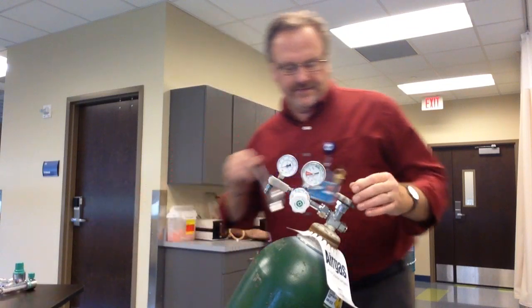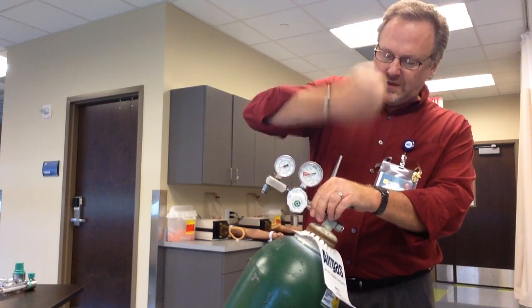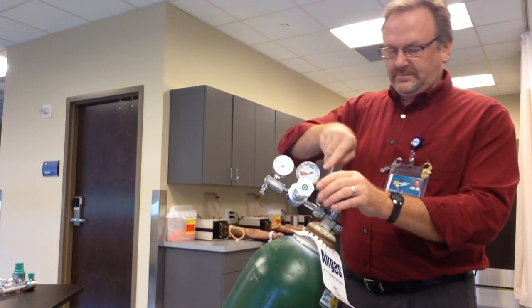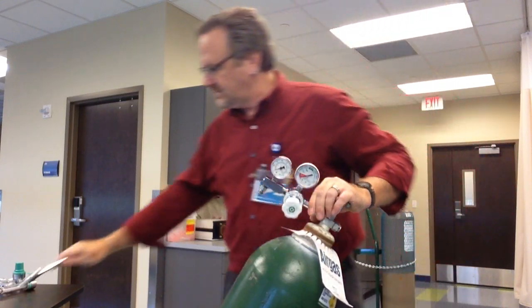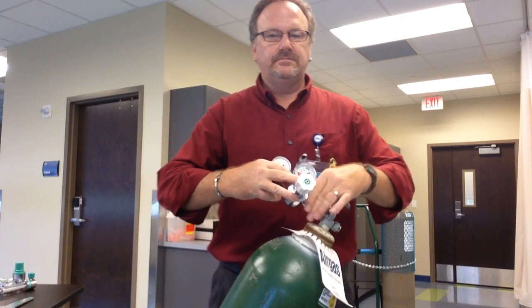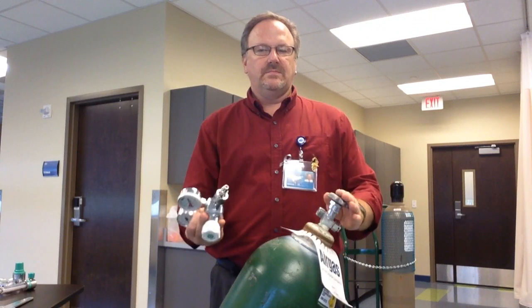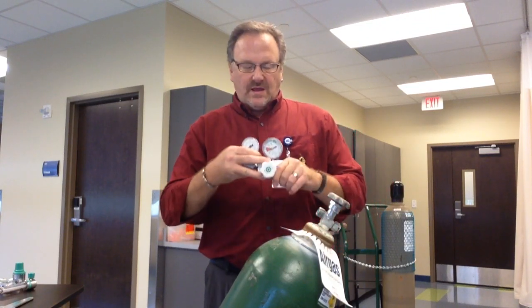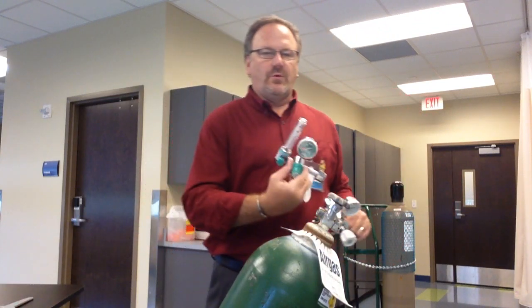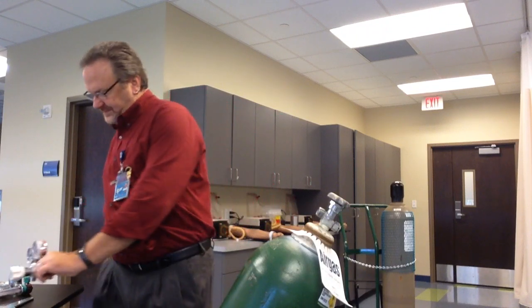Now I need to get this thing off. How do I do that? Well, you just cranked it on there pretty tight — it may be hard. Just little taps. That is it. This is, as I said, the Bourdon gauges and the Thorpe tube. We'll have another video over the actual flow meters.